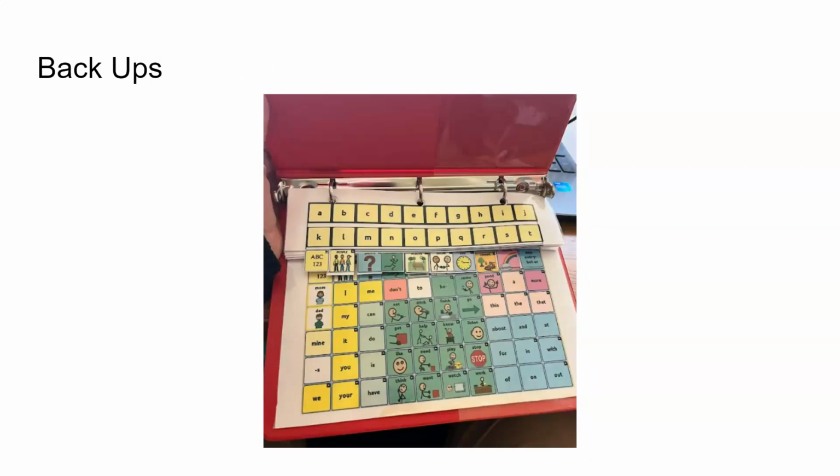From experience, we know things can happen with devices from breakage and not being charged or it being absent for a short period. This makes it important that the vocabulary is backed up. Your school team will show you how they are backing it up. It may be to school cloud storage or another method. The most important thing is to be backed up, and this also includes having something low tech so your child can communicate even if their device is absent.